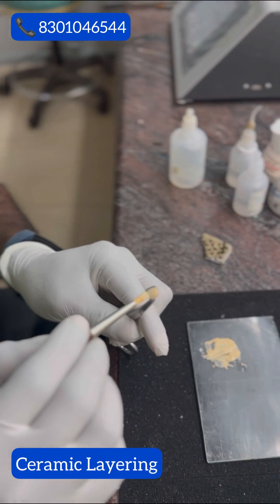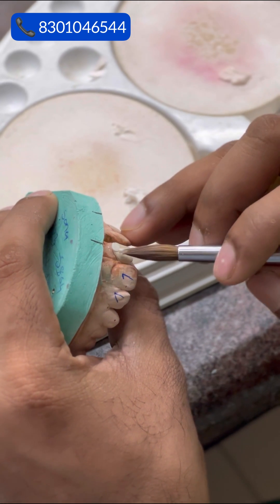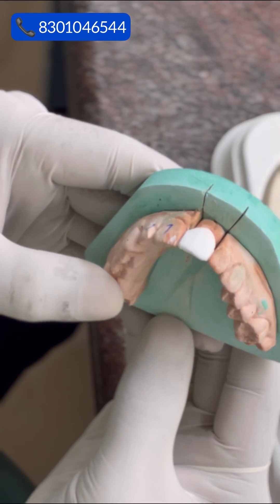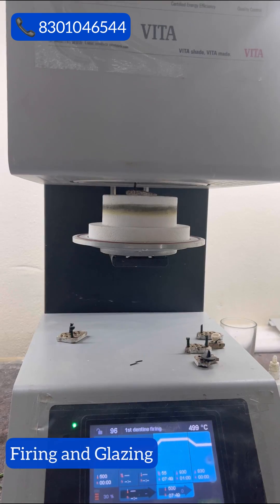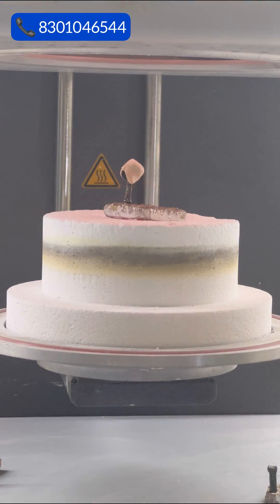Now comes the artistry. Layer by layer, the ceramic material is carefully applied to the metal framework, mimicking the natural shape and colour of the patient's tooth. It is then placed in the furnace once again, allowing the layers to fuse together and become solid.